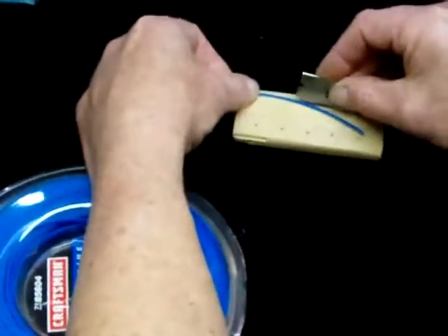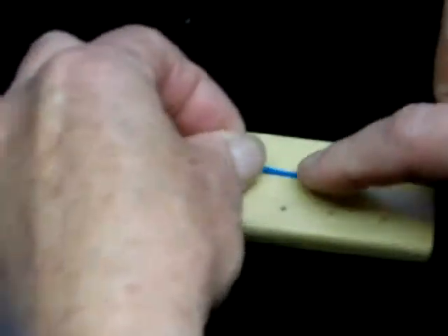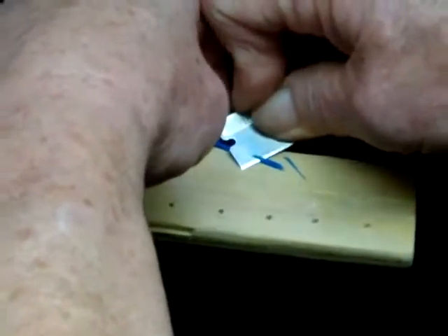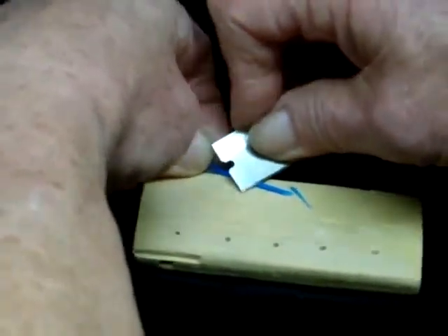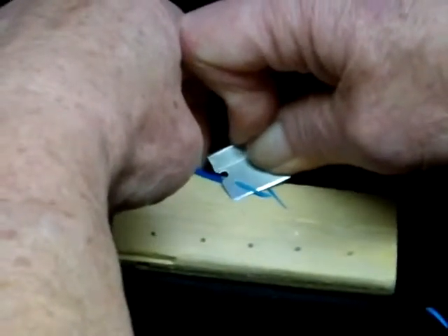of weed trimmer string. Even as thin as paper, this tough nylon is almost indestructible, so you can slice it as thin as needed to slip between your tightest teeth. Scraping with a razor blade teases flexible whiskers out of the core.